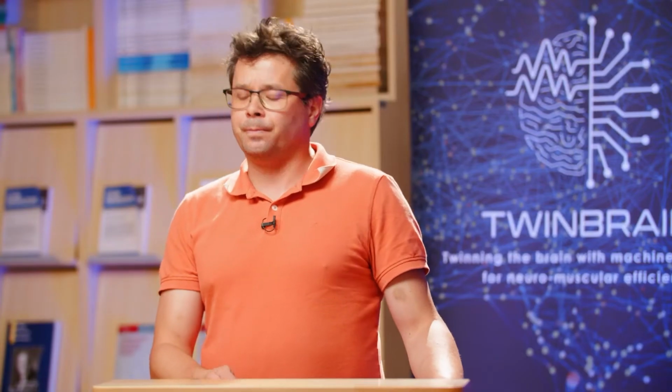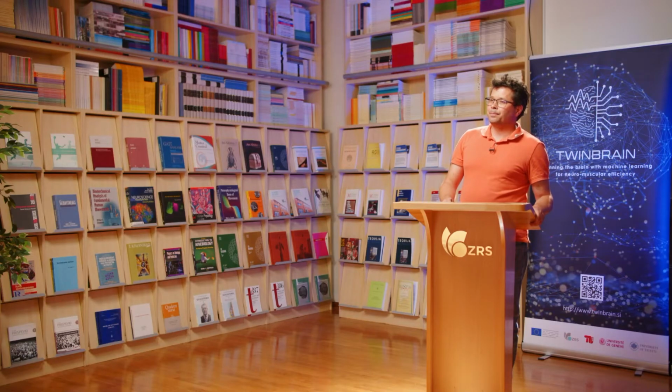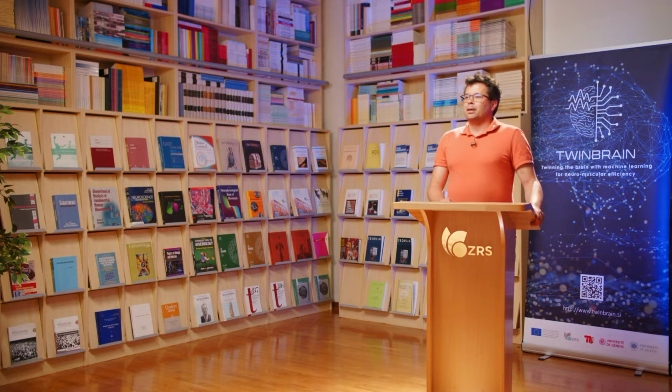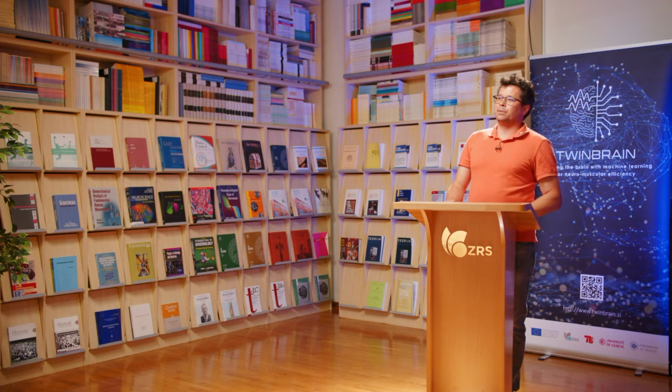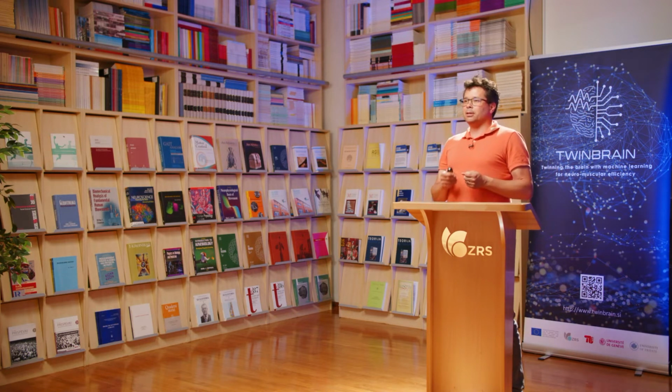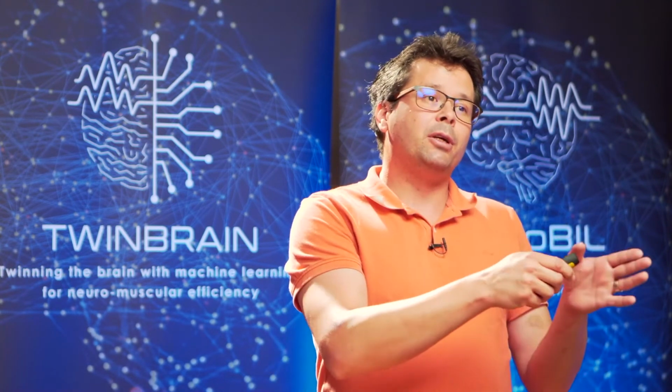Okay, and another question we have here is how is it related to overground walking versus treadmill walking? As far as I know, Mohammed said the force production on a treadmill is different from overground walking. So there are studies that did compare overground and treadmill walking, and there are some differences, but we use the treadmill here only for the training, not for the analysis.